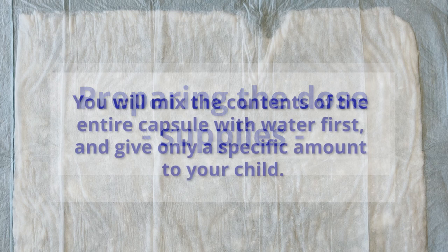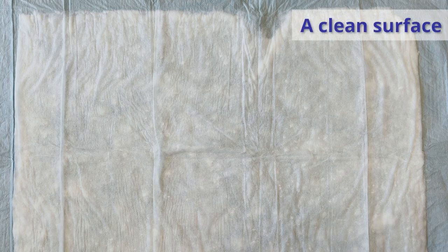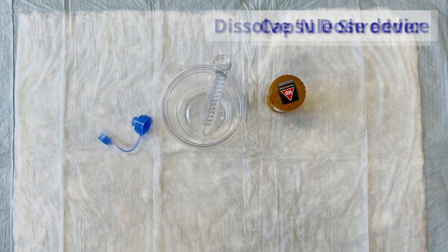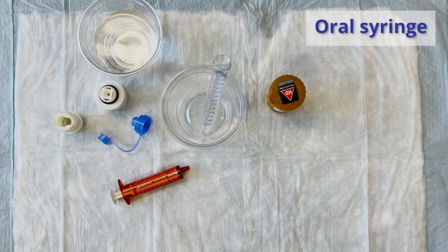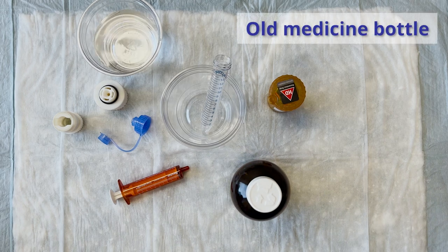Preparing the dose. You will need to mix the contents of the entire capsule with water first and give only a specific amount to your child. To mix and give a capsule, you will need: a clean surface, your child's medication, an empty cup, a dissolve and dose device, a capsule shredding device, water (amount specified by your healthcare provider), an oral syringe, an old medicine bottle with a child-safe lid to dispose of any unused medication, and gloves.